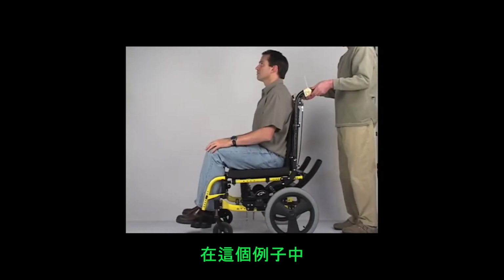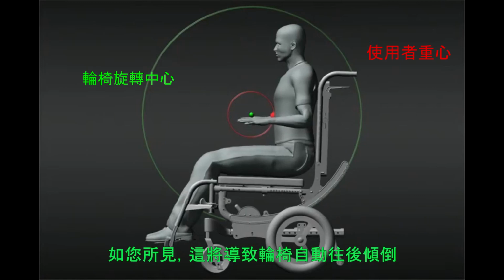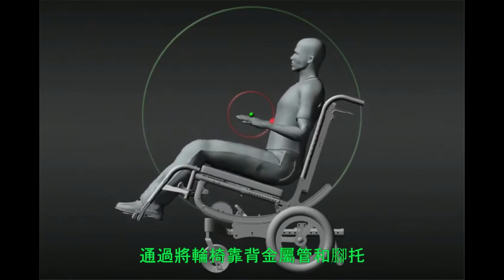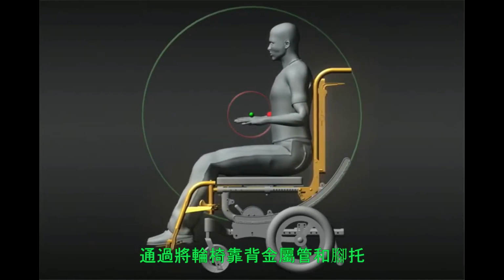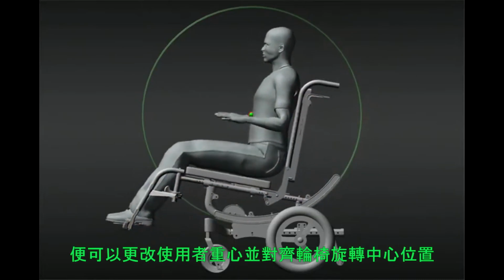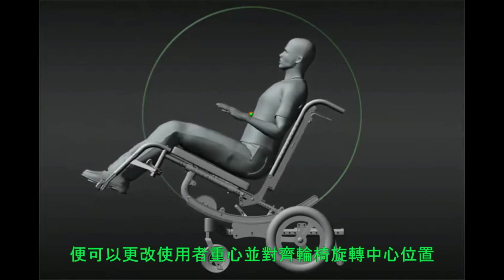So here we have an example of the center of gravity behind the center of rotation, and as you've seen, this will cause the system to fall into a tilted position. But by moving the back canes and the leg rest hanger assemblies an equal distance, you can change the relationship of CG and CR to bring them into alignment.